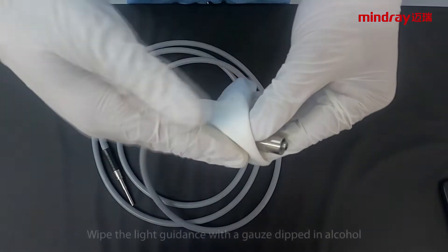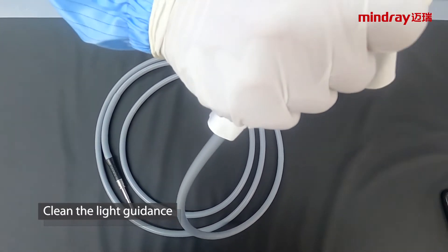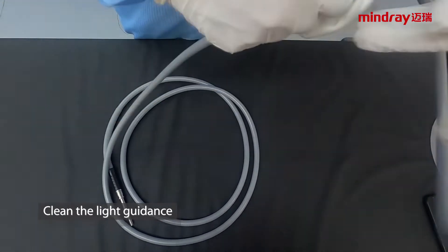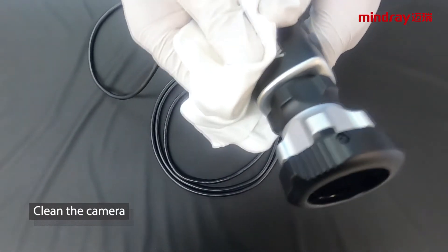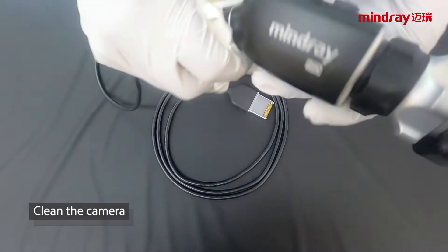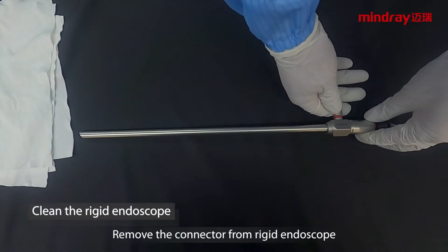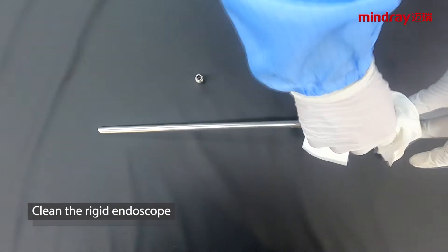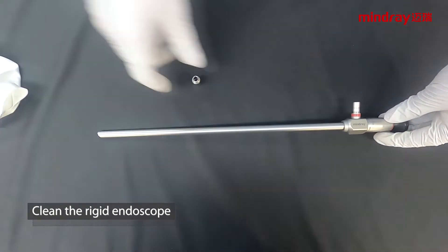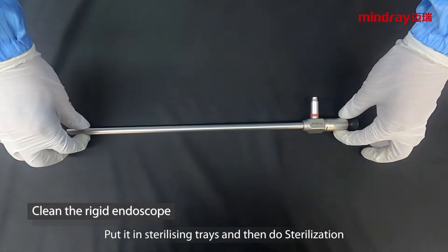Cleaning: wipe the light guidance with gauze dipped in alcohol. Clean the camera in the same way. Remove the connector from the rigid endoscope and wipe it with gauze dipped in alcohol, then reinstall the connector. Put it in sterilizing trays and perform sterilization.